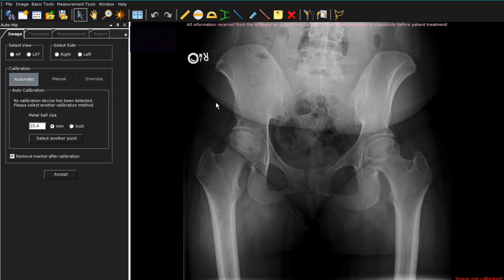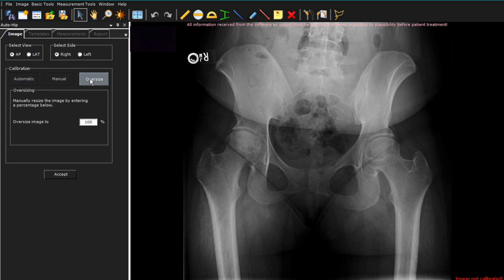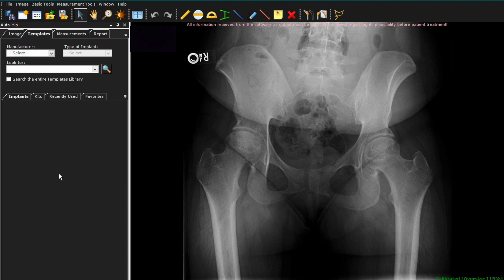This now pulls up your AP pelvis. You're now going to tell the software this is an AP view and we're going to be doing a right total hip replacement. Your choices here are automatic, manual, or oversize. I will use the oversize feature, typically with 115% oversize, and this has been very accurate in my practice. We now accept this.